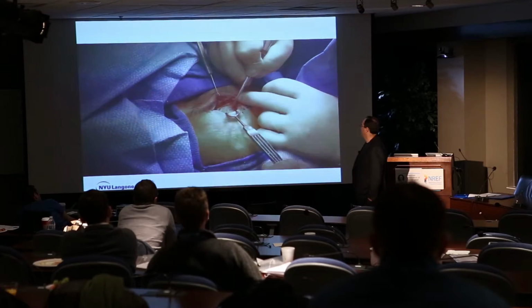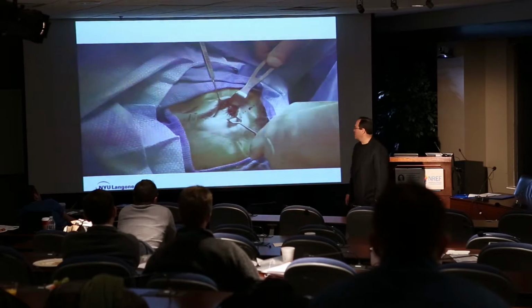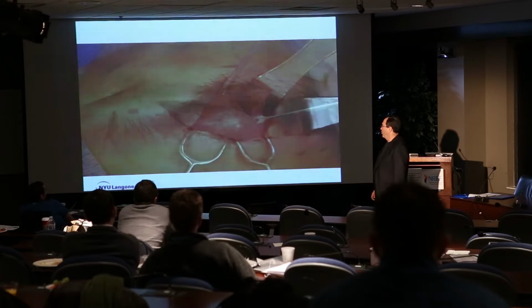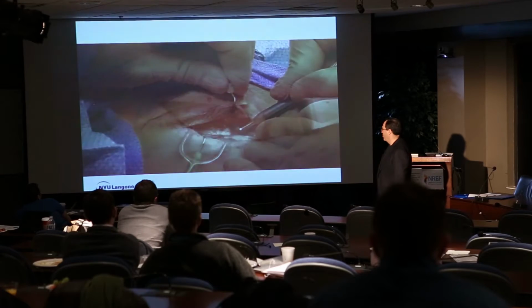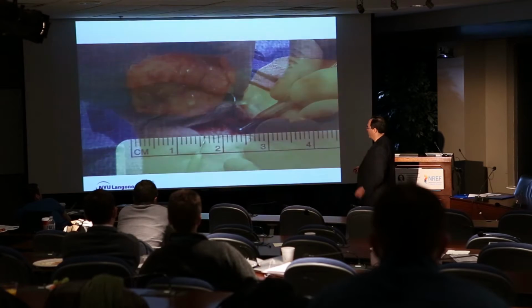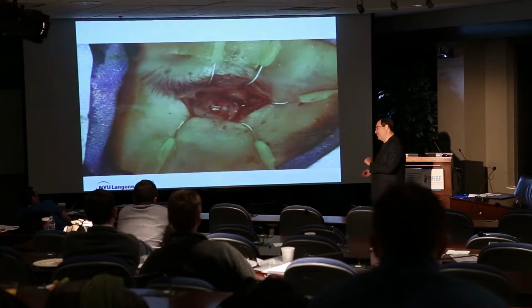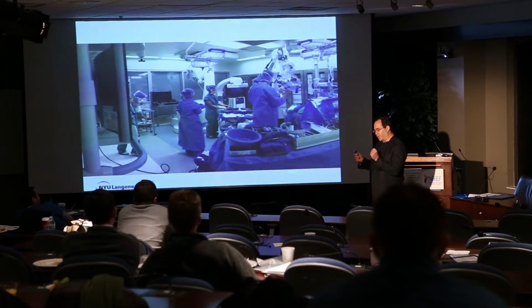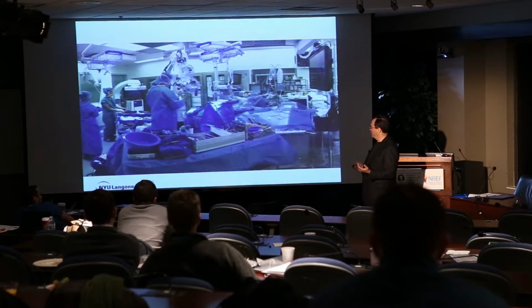It's a little local. And what I find about these small approaches, first of all, once you get used to them, there's the anatomic keyhole, where you make a little burr hole. Once you get used to doing them, it really gives you the same exposure that you would get through a much larger craniotomy. Remember, when you're doing an operation, you're really working in a very small space. The first one of these that I did, I got into some bleeding, and I was cursing myself for using this approach. But when I actually put the scope in the area to fix the aneurysm, it was in the same position it would have been in had I had a much bigger exposure.